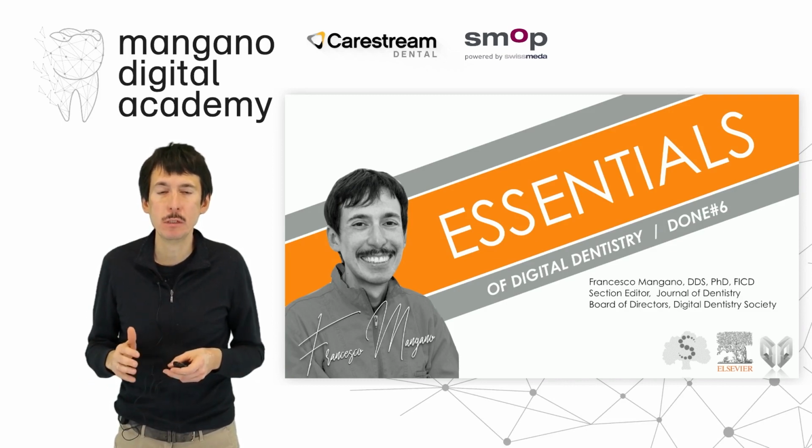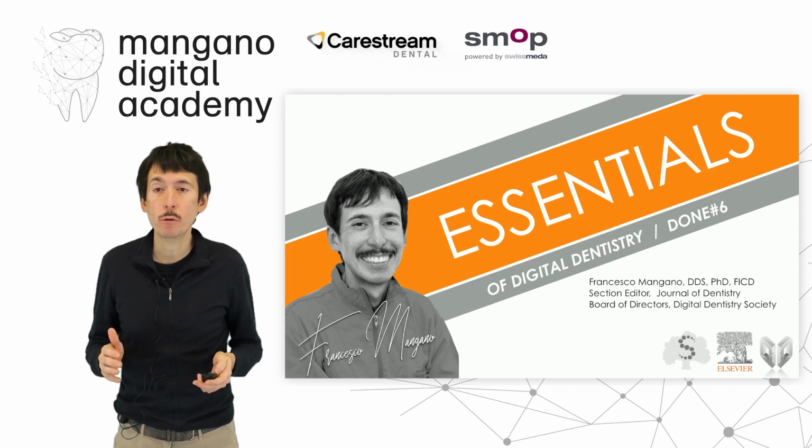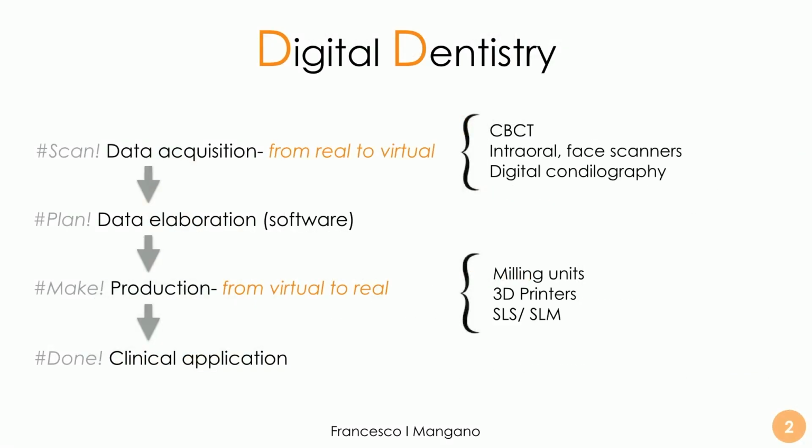In this sixth video of the last series, we'll talk about the full digital workflow again. So the resolution of a very easy case, an everyday case in our clinic by means of digital dentistry.